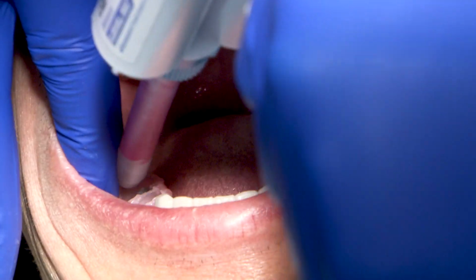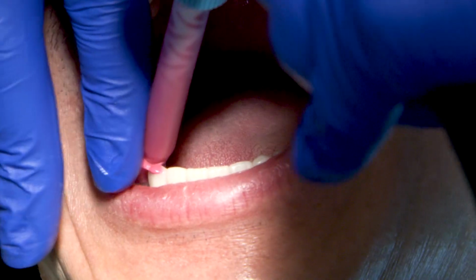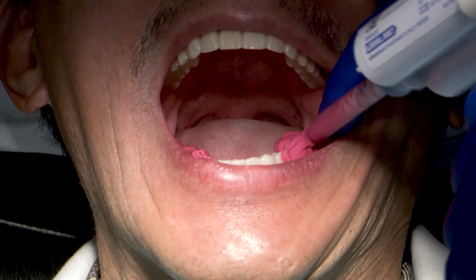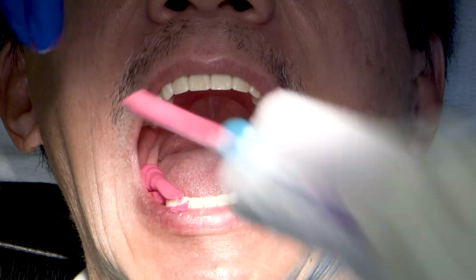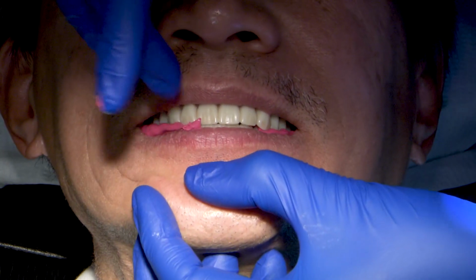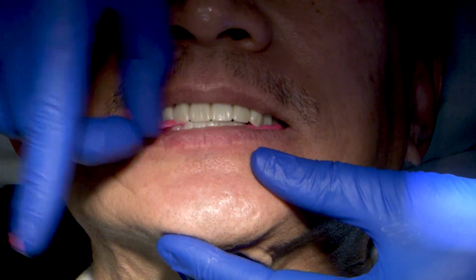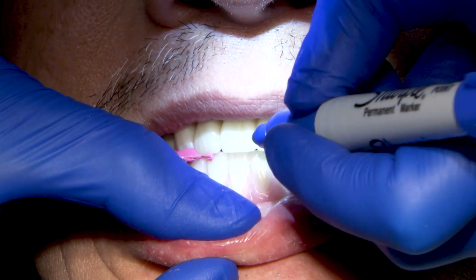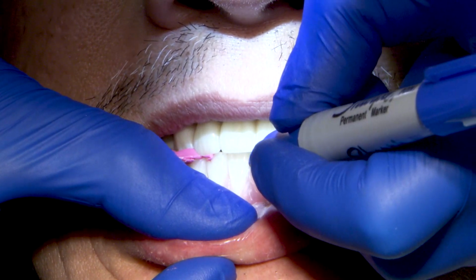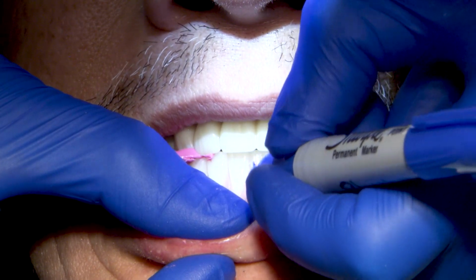Once the vertical dimension is confirmed, I'm going to have the patient close gently into a CR position. A leaf gauge, which I did not use in this case, can come in handy to help move the patient into a CR position if necessary. PVS material is then flowed into the posterior sextants, capturing the new bite registration. Notice the midline is slightly off to the right side as well. Marking the midline is an easy way to inform the technician of the midline change.